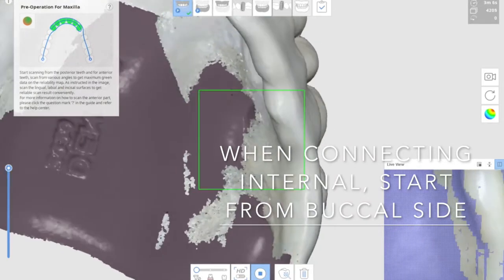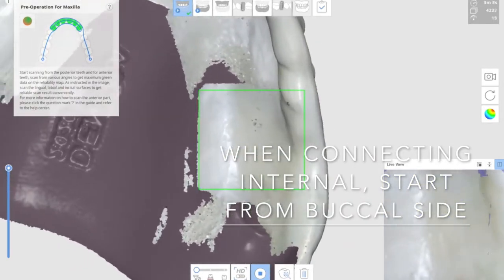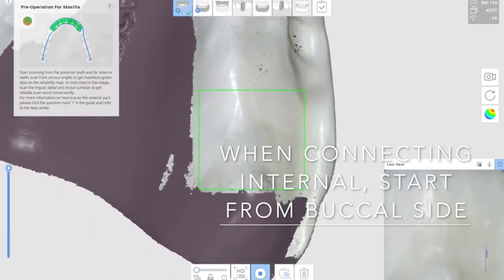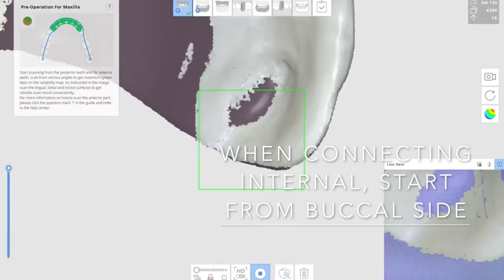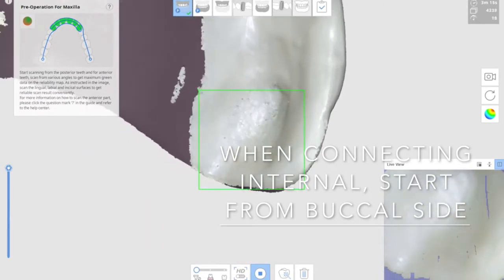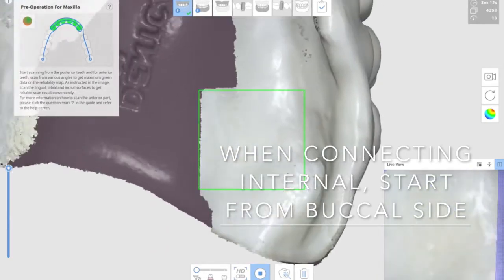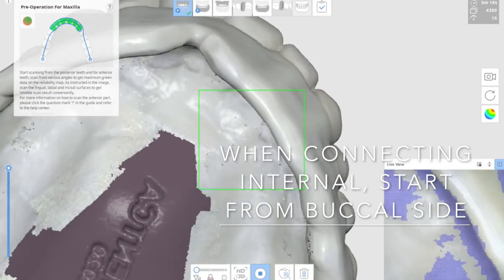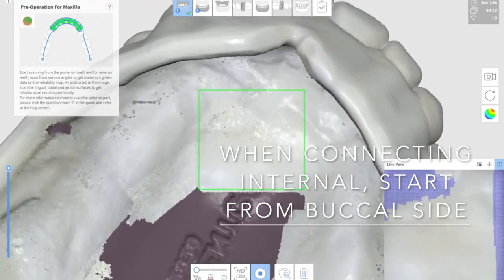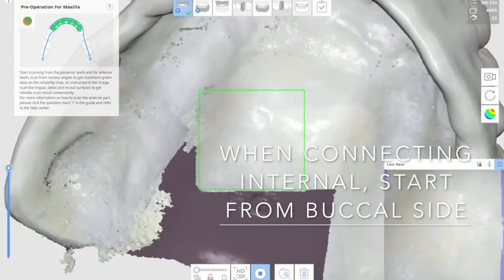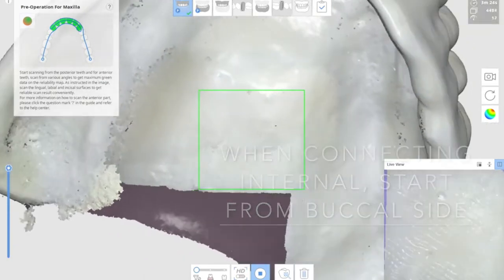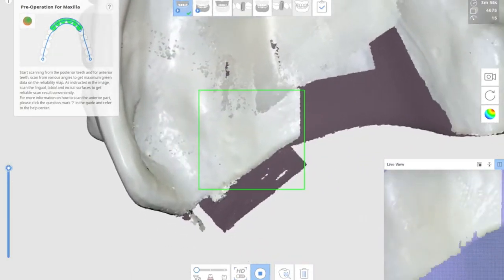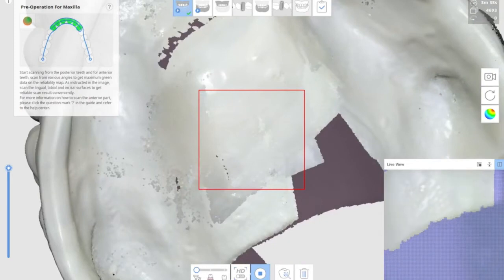Now, the initial internal surface got captured. Then you could connect the internal surface using zigzag motion. Making it this way, you are avoiding any mis-fit of scanning.